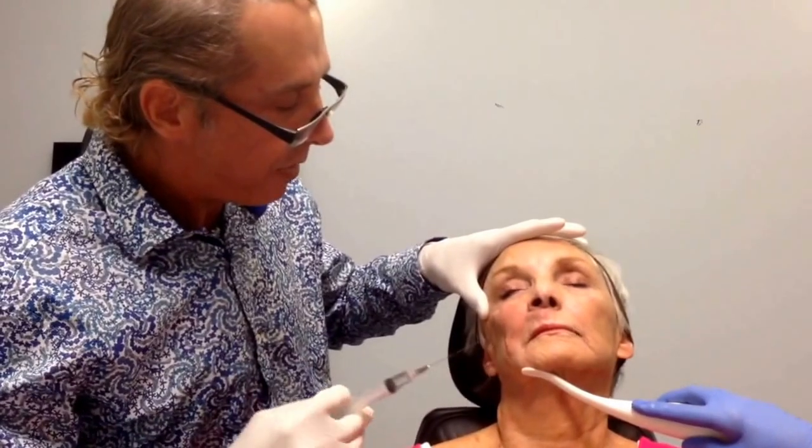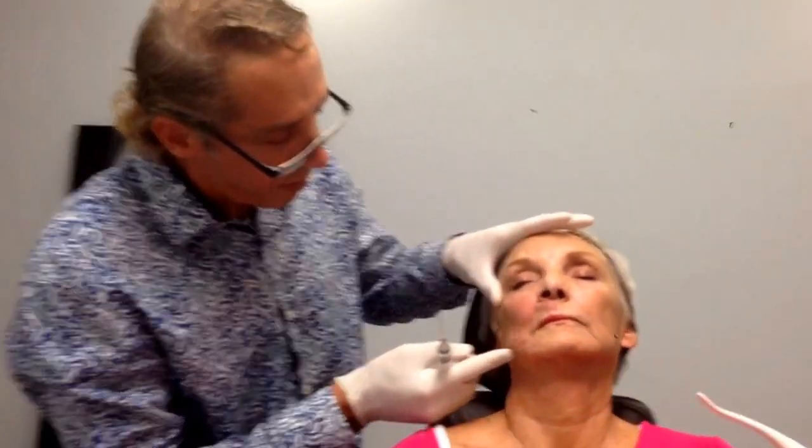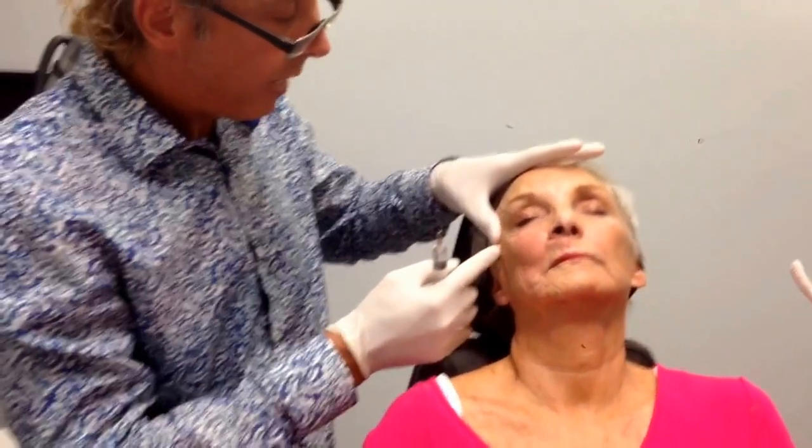So what I've done here is I've blocked here, over here, down in the jawline, the V2, the temporal zygomatic, and the temporal area. So she's now blocked, and I used 7 cc's of that material. Thanks.